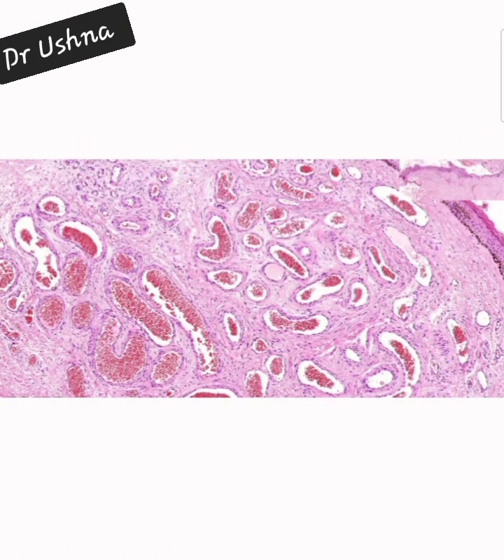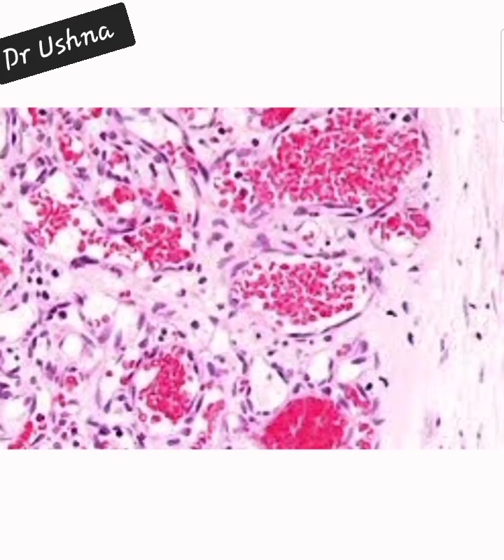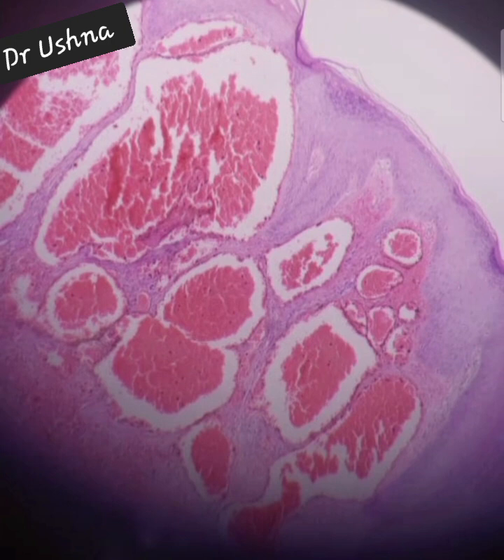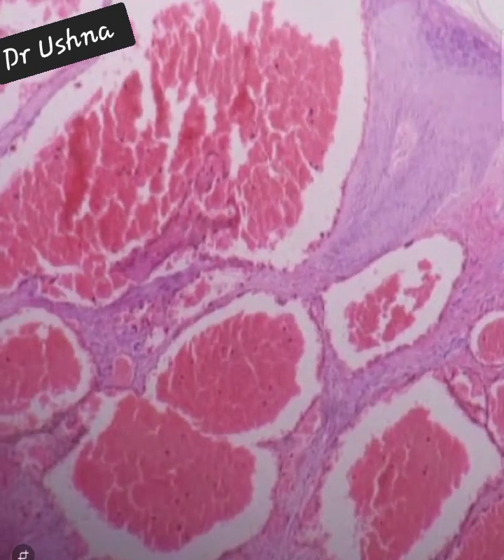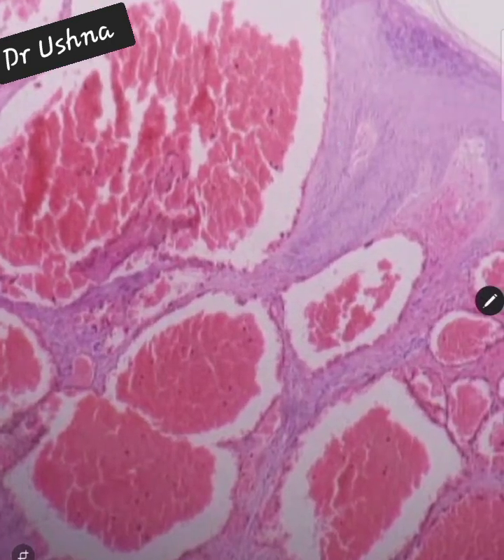These are again different collections of capillaries lined by a single layer of endothelial cells, and the capillaries are surrounded by septa. This is again the collection of RBCs surrounded by a single layer of endothelial cells. When you focus on the microscope, you see lobulated structures with RBCs or blood collection inside, and when you magnify the image there is a single layer of endothelial cells — this is your capillary hemangioma.